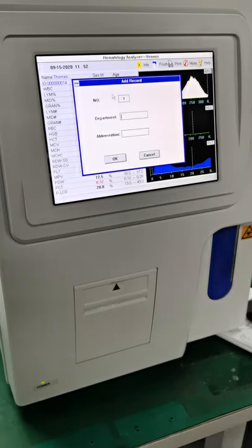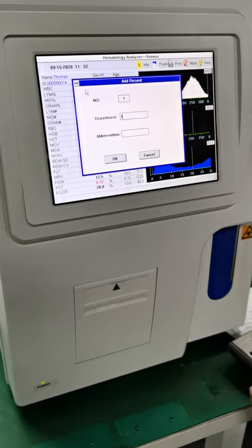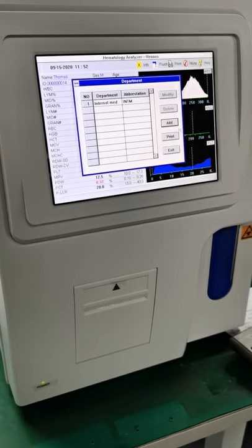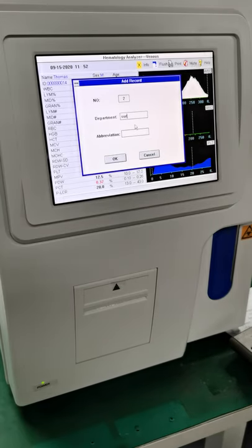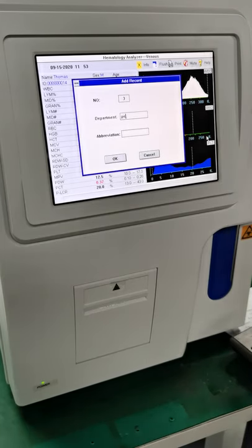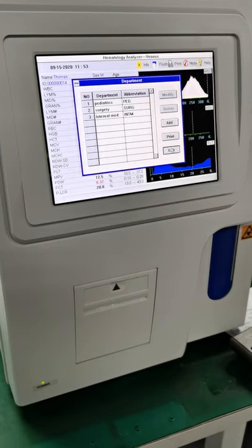Department, let me type with my keyboard. Let's say internal medicine. Okay, abbreviation, maybe you can just write INTM. Okay, and I can add like one more, like surgery department, abbreviation SURG, done. I can add one more, like pediatrics department and PED. Done, okay? Just like that, okay?